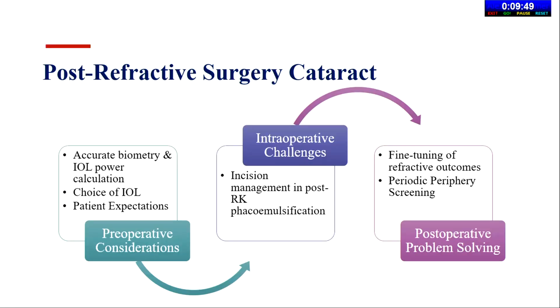Thank you, sir. A very good morning to all of you. I'll be tackling the post-refractive surgery cataract, no financial disclosures. So the challenges that lie with us are preoperatively accurate biometry and IOL power calculation, the choice of IOL, and addressing patient expectations. Intraoperatively, incision management in post-RK phacoemulsification. Post-LASIK and PRK are relatively simple to manage. Phakic again poses intraop challenges regarding explant of the phakic. Post-operatively, fine-tuning of refractive outcomes and periodic peripheral screening.